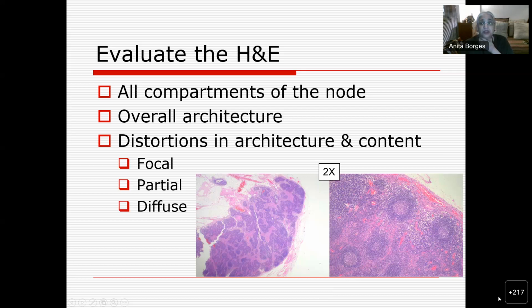And even if they do have a personal microscope at home, they are very unlikely to have a 2x or a 1x objective, because these are horribly expensive. Okay, but maybe your head of department has a 2x lens that is attached.